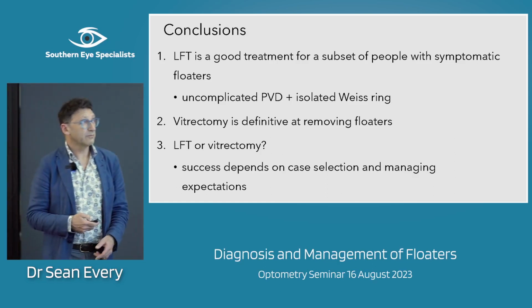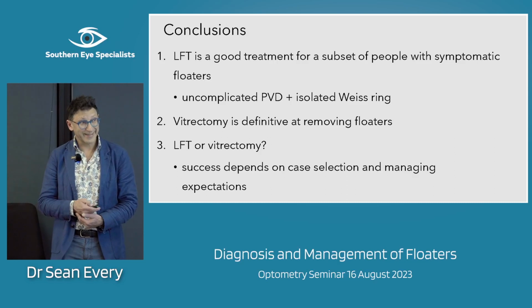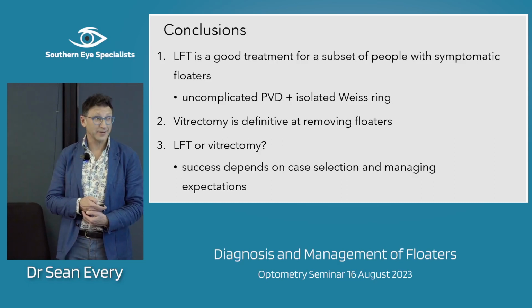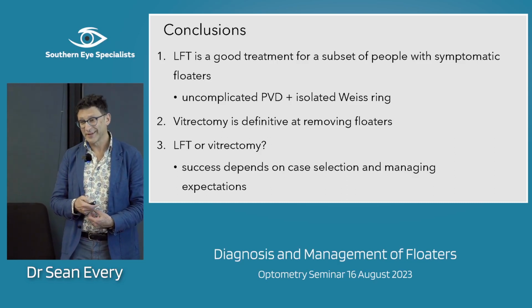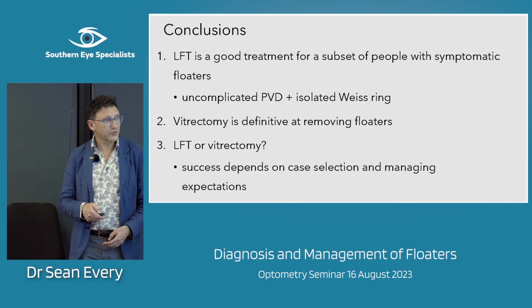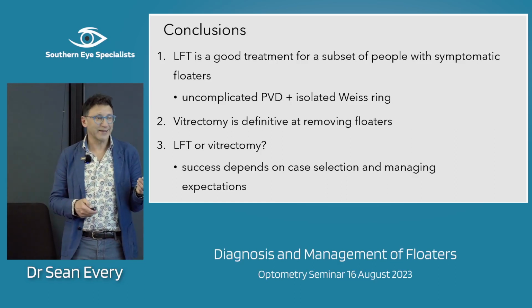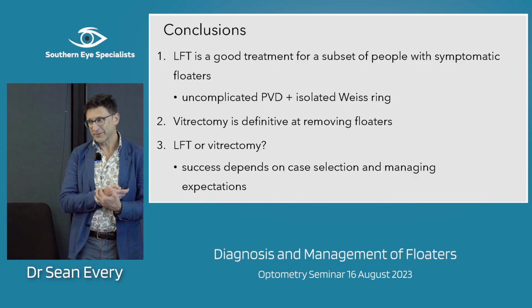So, conclusions: it's a good treatment for a subset of people with symptomatic floaters, and basically that is it. That's all of it. Just these people with an isolated Weiss ring and not much else going on in the vitreous cavity. Obviously vitrectomy is definitive. Which one? Well, it's all about case selection and trying to manage their expectations.